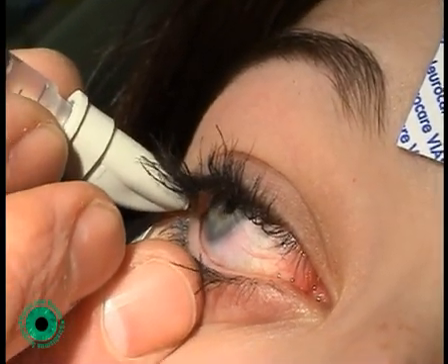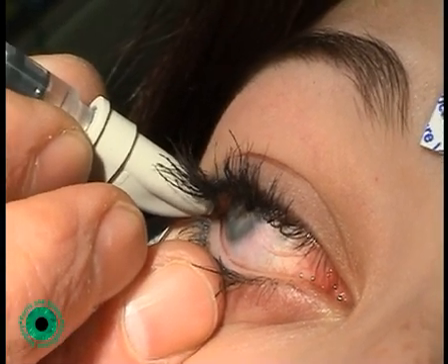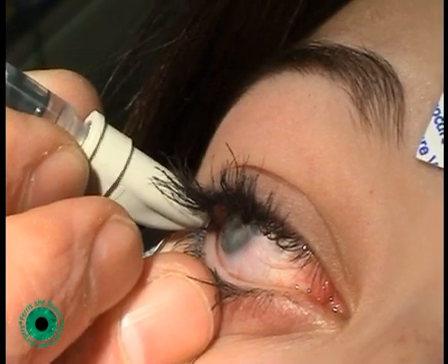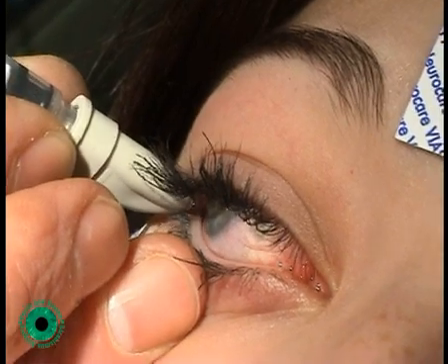When the EMG signal increases, indicating that the needle is in the muscle, 7 units of Dysport and 0.1 mls of normal saline are injected. At this point the EMG signal diminishes.